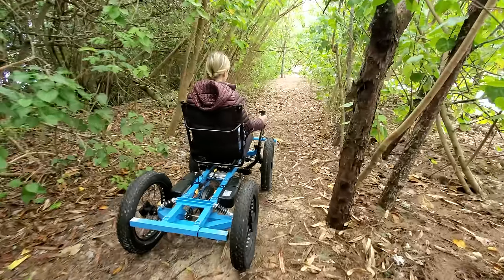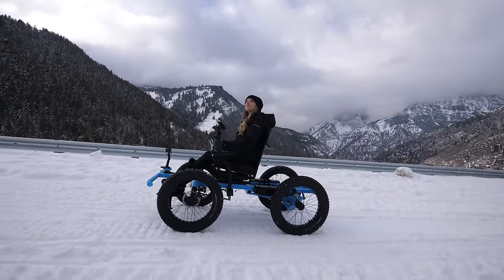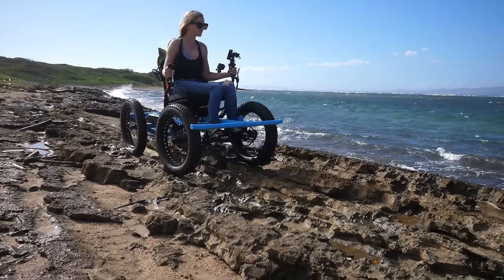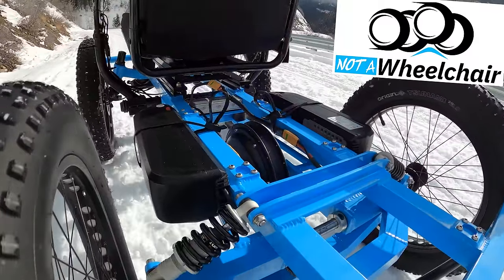We've been through several different versions of this rig over the past year and now we finally have something we're really excited about. It's hard to define exactly what this is. What do you call a chair with four wheels, off-road capabilities, totally silent, super fast, and a pretty long range? I'm not really sure either, but it's definitely not a wheelchair.